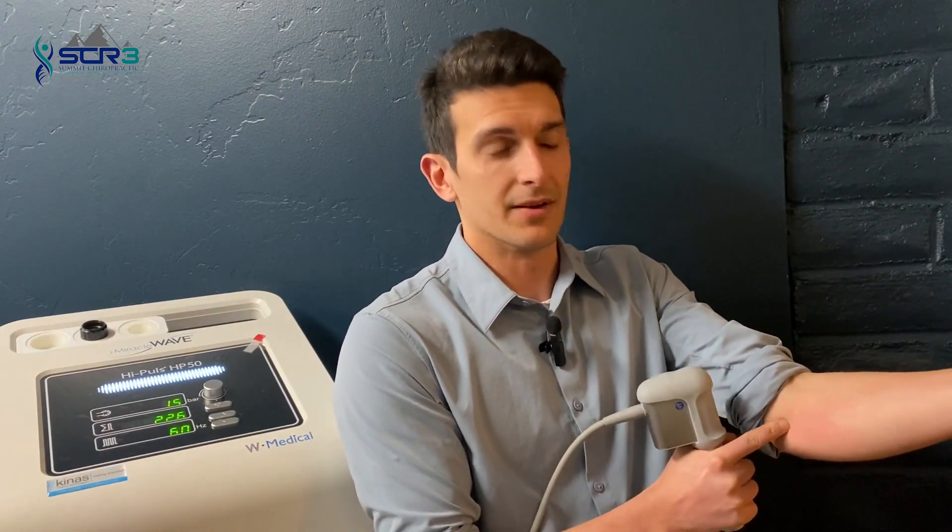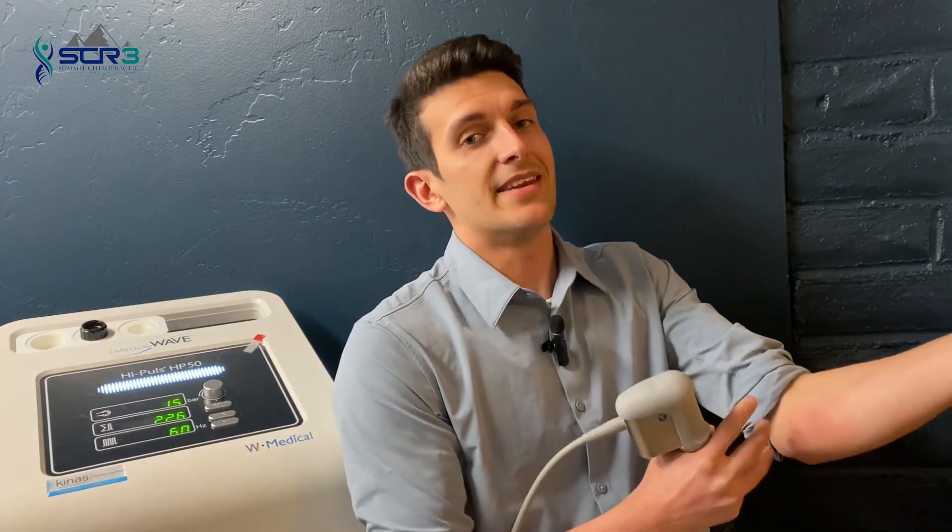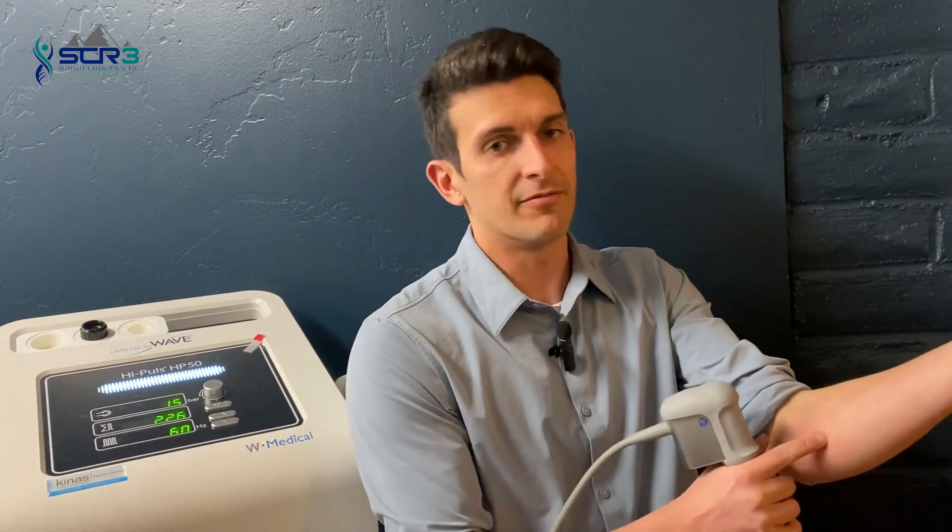You can actually see a little bit of redness here — that's the nitric oxide release, which is going to dilate my blood vessels to ensure that a large amount of blood flow gets to this area. Increasing that blood flow is then going to increase the amount of healing that can happen in the regions treated by the shockwave device.